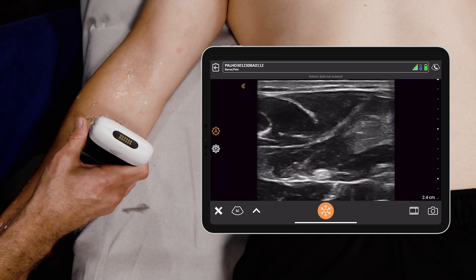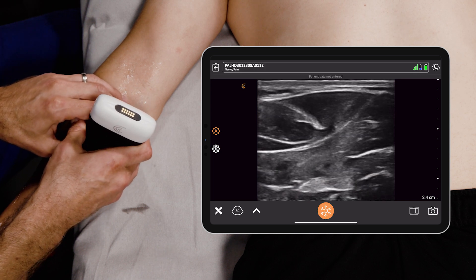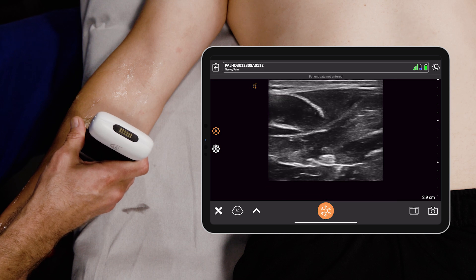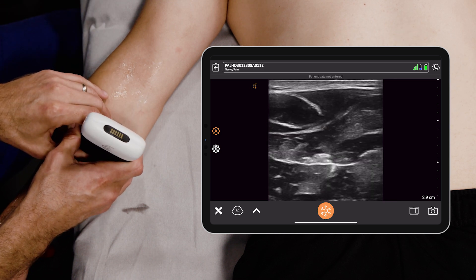It kind of has a fascial layer below it, and it's honeycombed, and it has what's called anisotropy. So when you rock back and forth, the nerve can become darker and lighter. That's characteristic of the nerve.